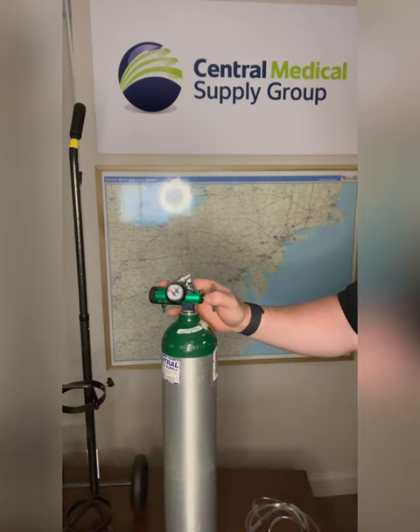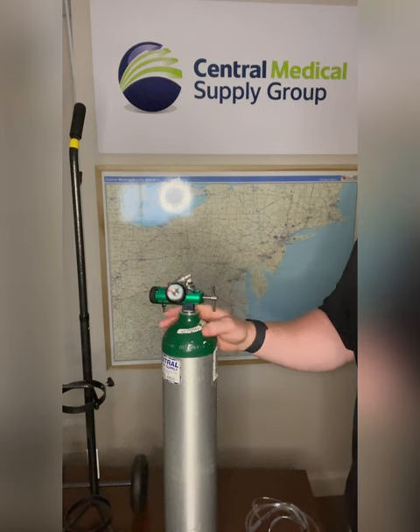If the regulator is not working properly or secured correctly, you will hear a loud hissing noise coming from the tank.